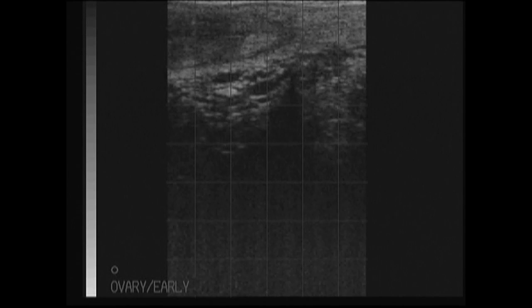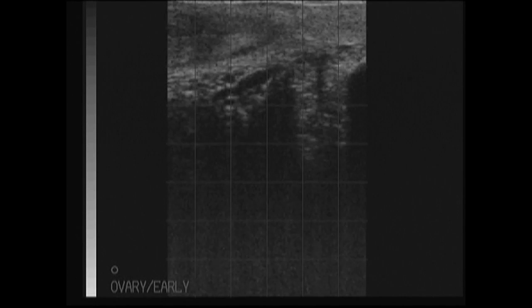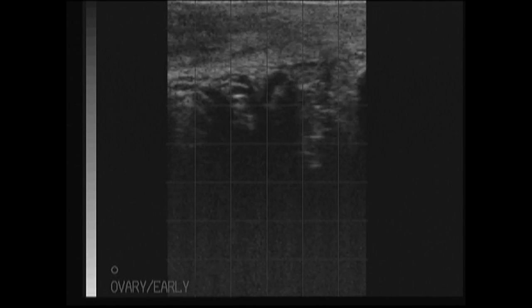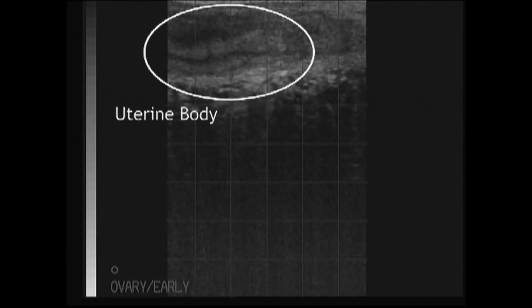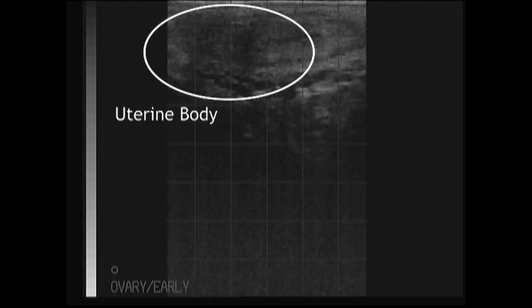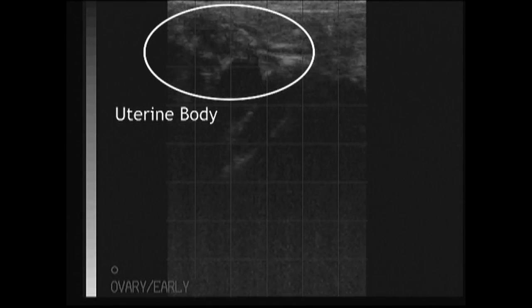We will now evaluate the reproductive tract in this non-pregnant cow. The uterine body can be seen at the top of the screen.